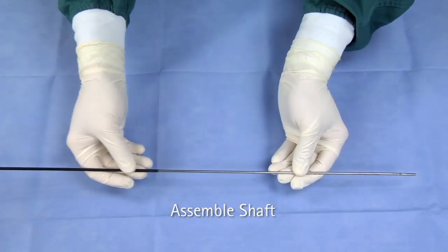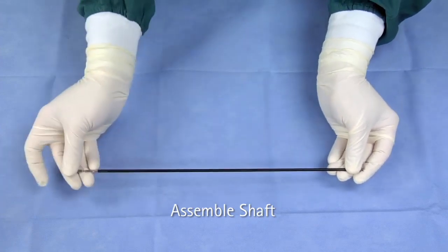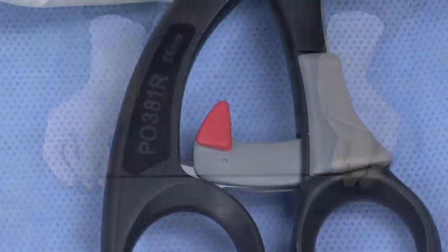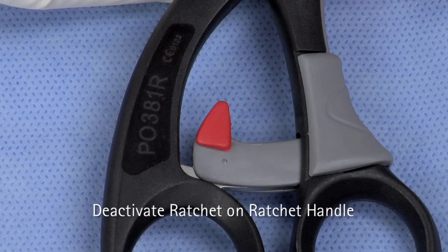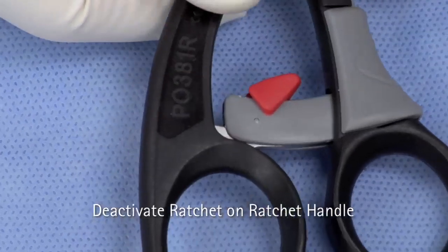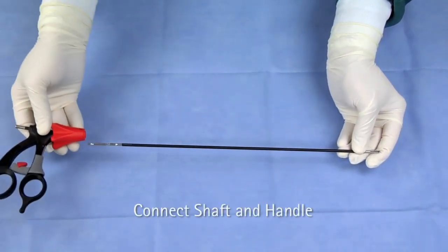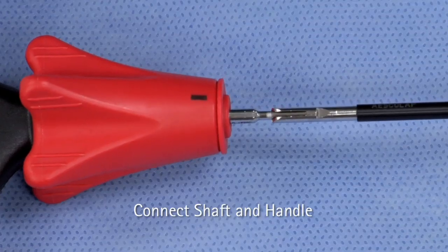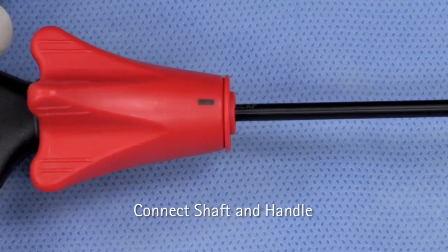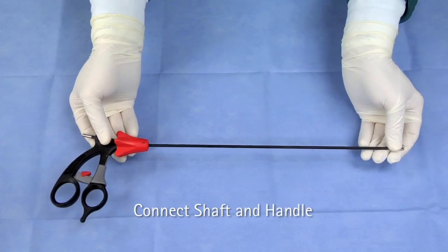Slide the outer insulation tube as far as it will go over the jaw insert. If you are using the ratchet style handle, deactivate the ratchet by flipping down the red toggle switch. Hold the tip of the shaft and slide it into the handle until it locks into place, making sure that the jaw insert notch is in line with the mark on the rotation knob. Do not touch the movable part of the handle.